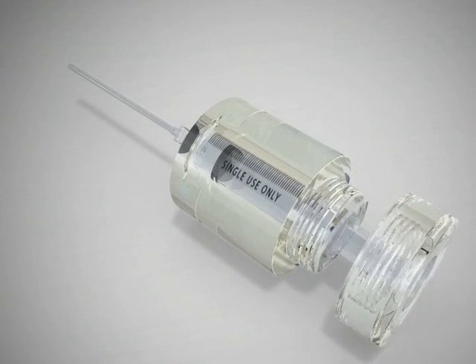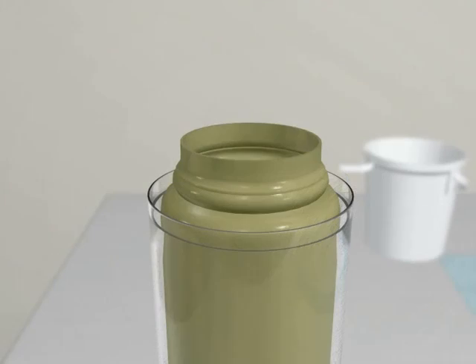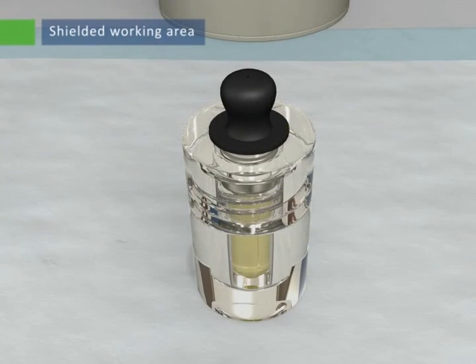Unscrew the syringe holder and remove the syringe and needle. Dispose of both the syringe and the needle into an appropriate radioactive waste container. The patient-specific activity of SIRSpheres microspheres is now ready for transport to the angiography suite in which the implantation will be performed.